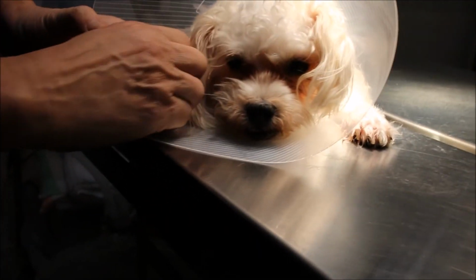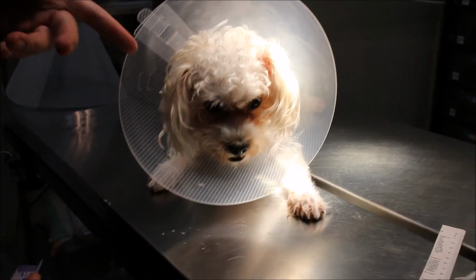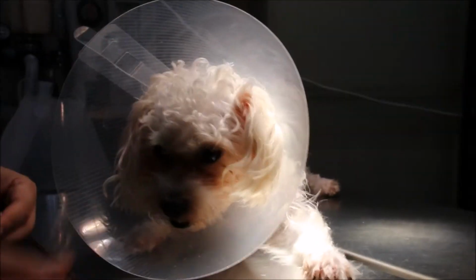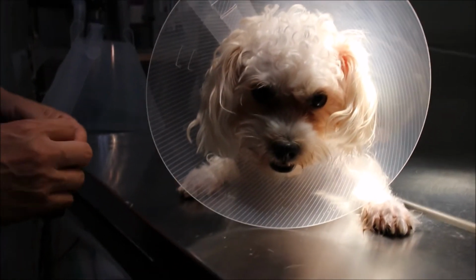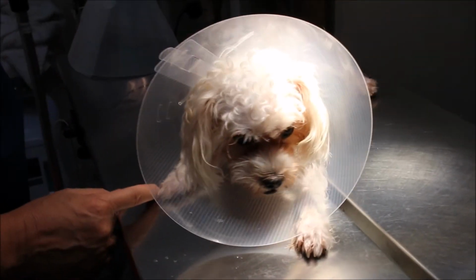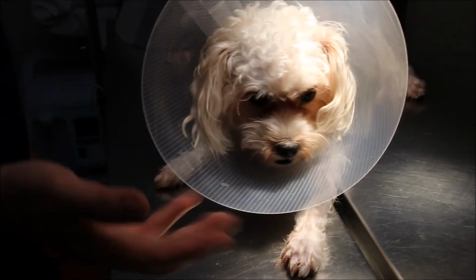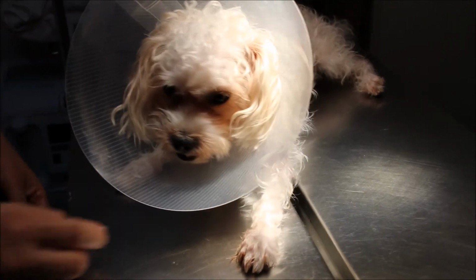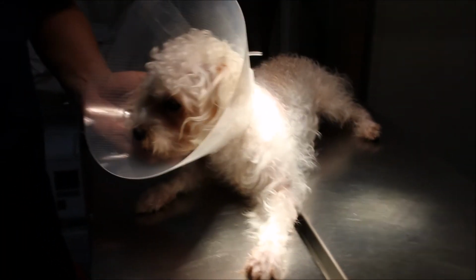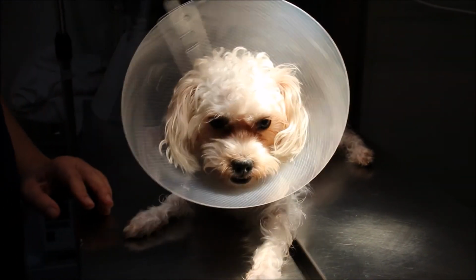Now we give the e-collar to prevent any biting. Then painkillers. See the dog? That's less than 5 minutes from the injection of Antisedan. Some vets prefer not to inject and let the dog wake up by herself. For me, I prefer to inject so that the dog is alert and respiration is back to normal, so that I don't have to worry whether the dog is going to sleep a long time or not.